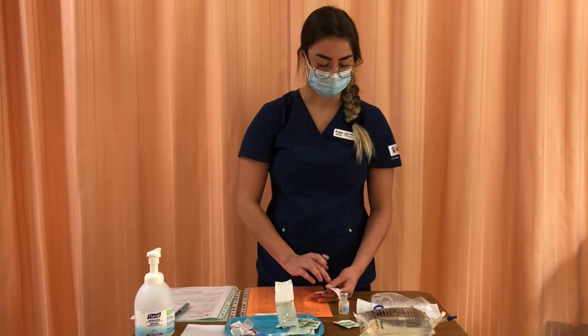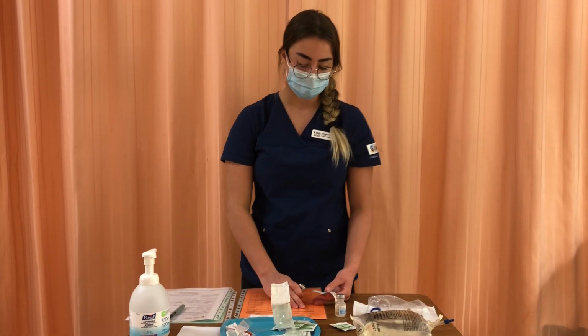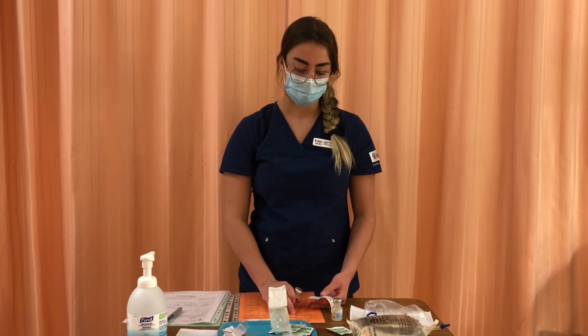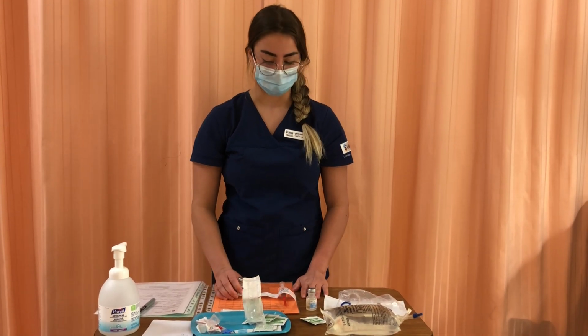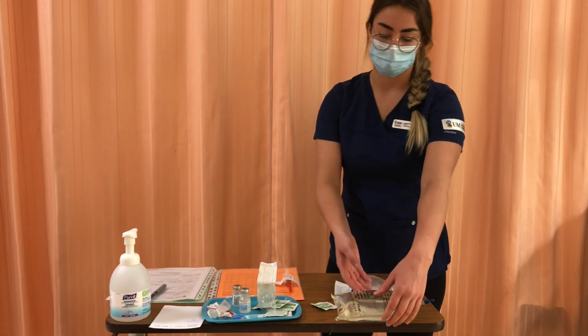And this is going to be injected into a mini bag for IV administration. Right time and frequency, daily. It's scheduled for September 15th, 2020 at 0600. No one's given it, no one's signed for it, so I'm okay to give this medication. Okay, once I'm done that, I don't need my medications, they can go back. And then I'm ready to dilute it in my mini bag.